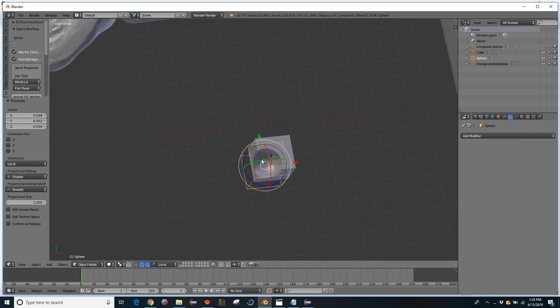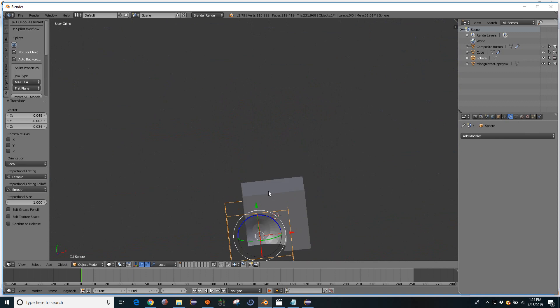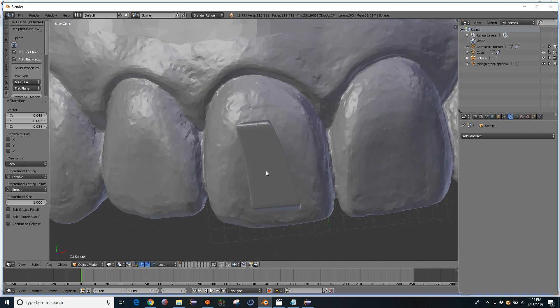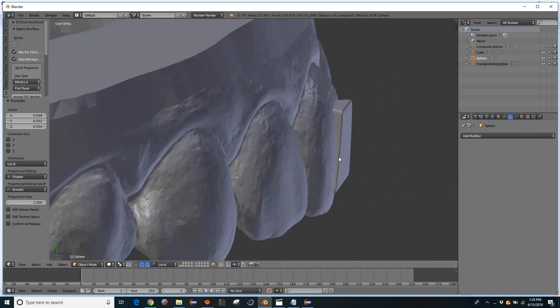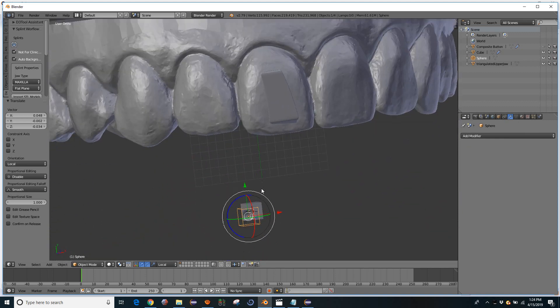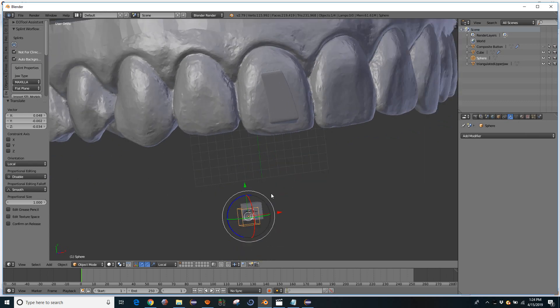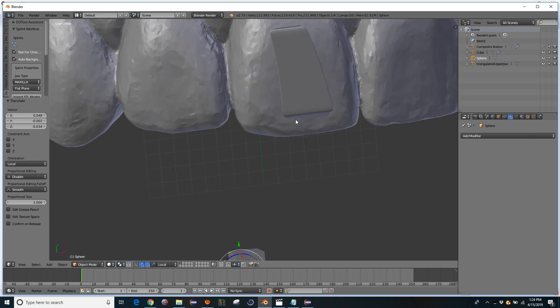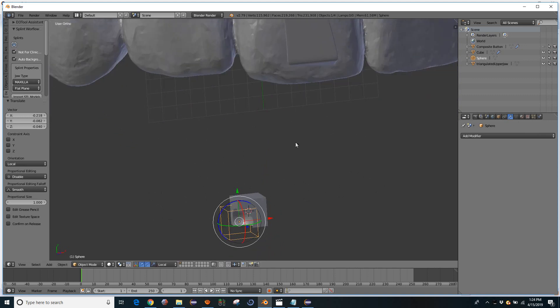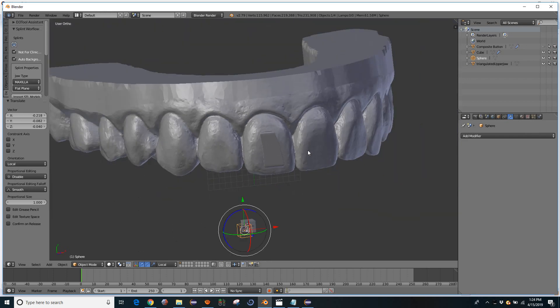So that's kind of the difference of Blender's modifier system versus Boolean unions and stuff in MeshMixer. It's a little more geared towards animation, but when you do heavier intersections of bigger objects, it doesn't work as well, keeping it live like this. It does work fine as long as you add the modifier and then apply it.